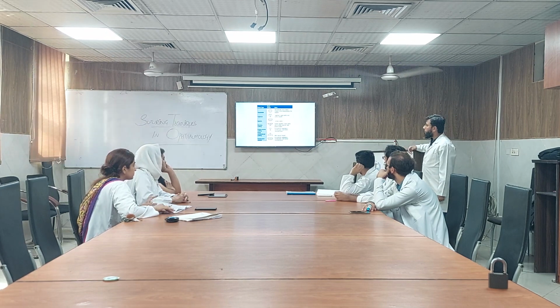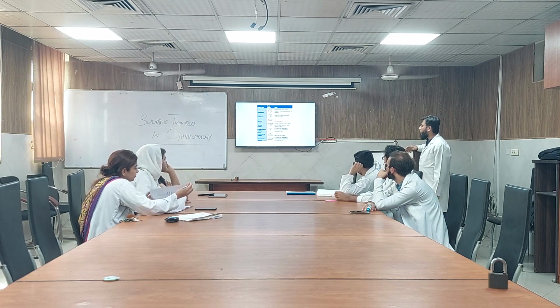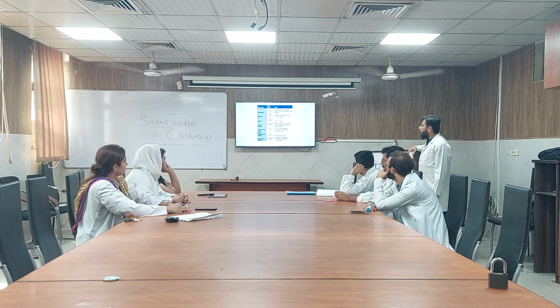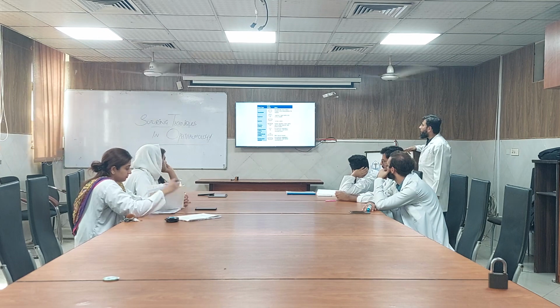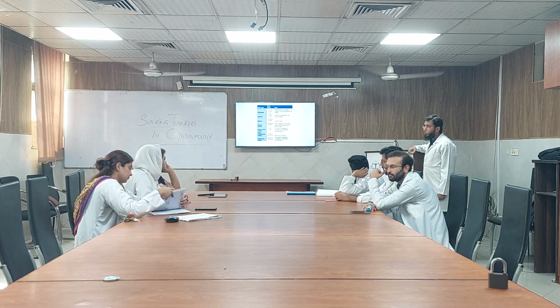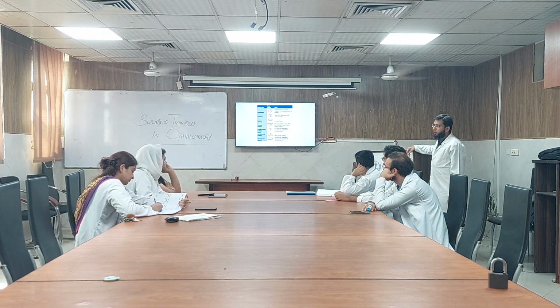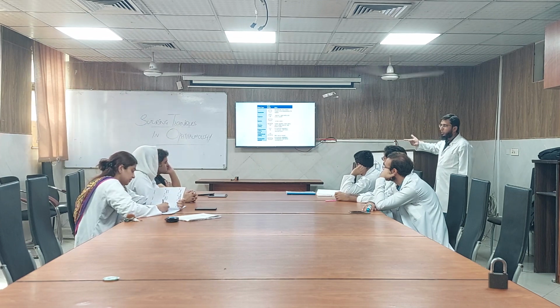These are different types of needles which we use in surgery: taper point, taper cut, spatula, reverse cutting, prime reverse cutting, prime conventional cutting, and the center point spatula. And its uses are also written in the second column. For example, the taper point is usually used for aponeurosis, dura, fascia, muscles, nerves, subcutaneous fat, and the vessels. Spatula is usually used in the cornea and sclera, very commonly used in our surgeries, for example while tying the sclera after any retinal surgery.